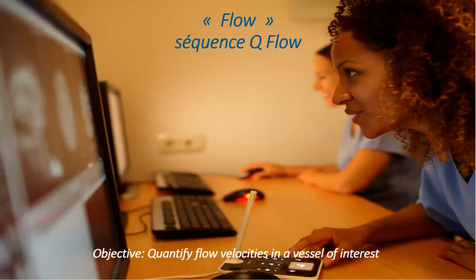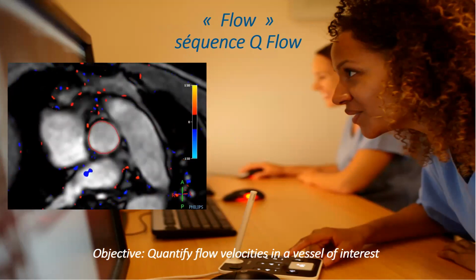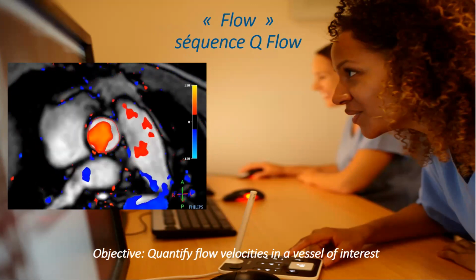The flow study will move now from the flow sequence. We use the Q flow sequence. It's to quantify the flow velocity in some vessels of interest. Here we can see the flow by giving a color scale for each movement.